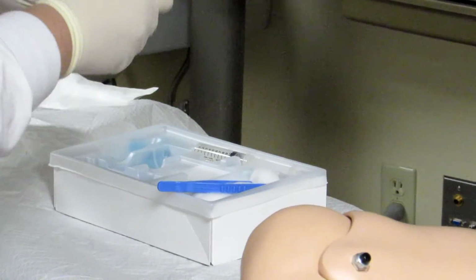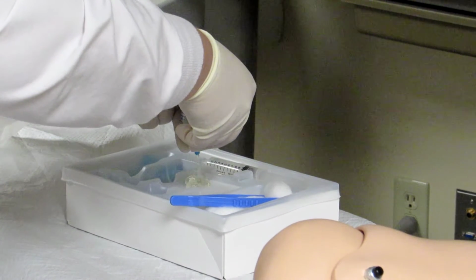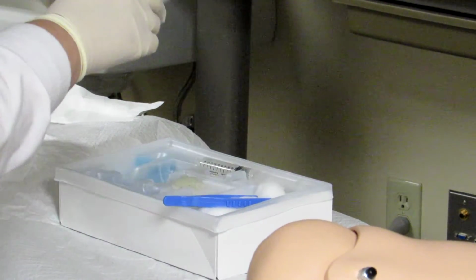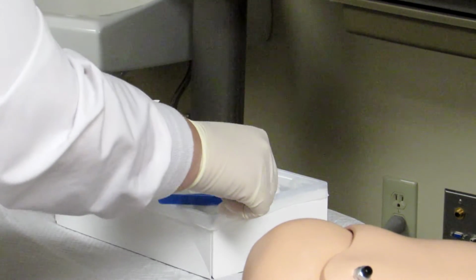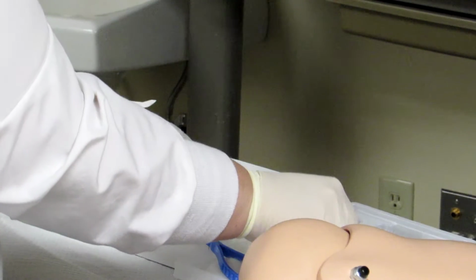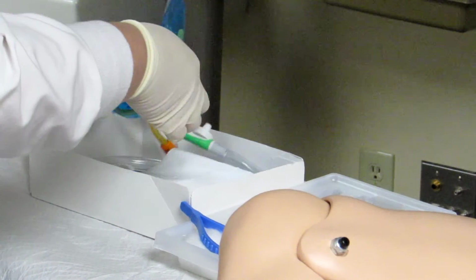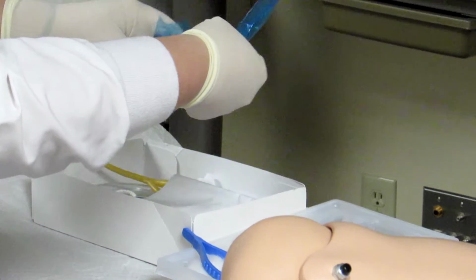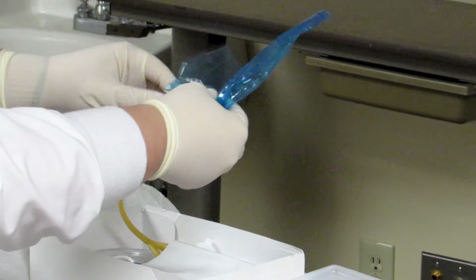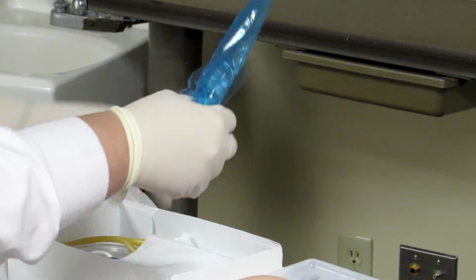I got my lubrication, so I'm actually going to put that right into the kit. When you're using your kits at home, I don't want you to do this because you'll get your kit all messy. So I got the top part set up. I can set this right to the side. Now I want to prepare my Foley catheter. I'm going to very gently, like I showed you in the first video, take off the bag that's on it. And you see me working my hand up the catheter there and stabilizing it as I'm pulling this bag off. I can set it right down in there.